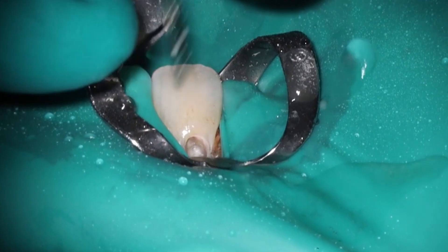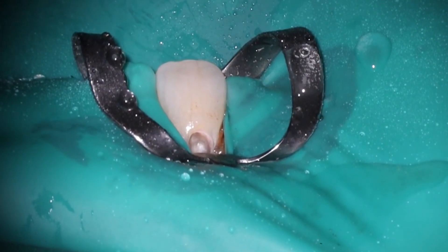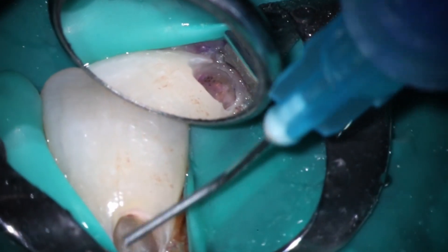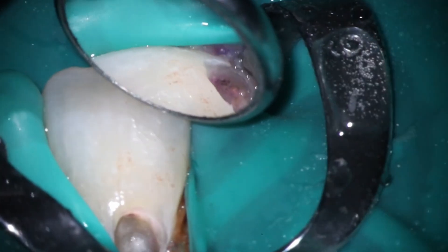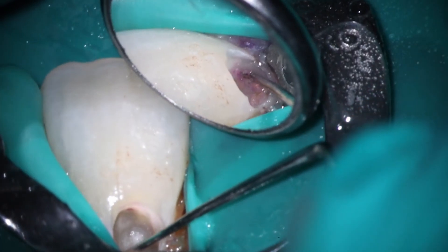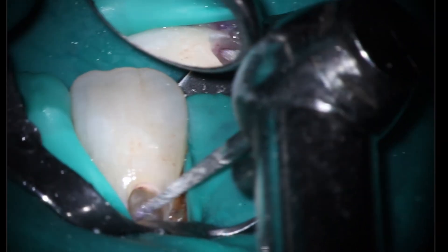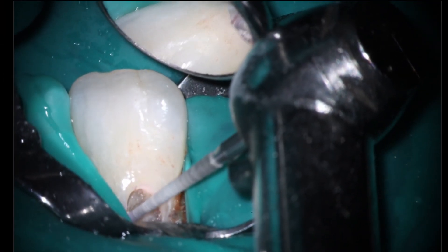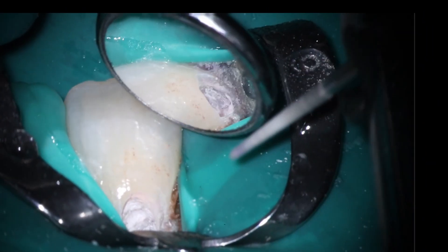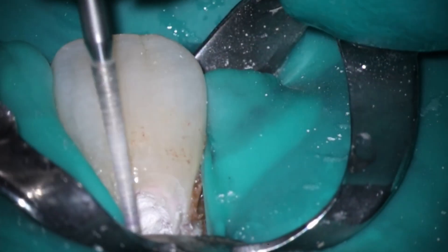Right now the rubber dam is actually on tooth structure. When I've done these in the past, the resorption has been so deep it's actually gone straight to that area where the bone meets the tooth and you actually have to put it on there. You can see right in that spot there's still a little bit of resorption, so I'm going to go back in and remove that. Just want to get out as much as possible using that endo explorer — you can see the stick right there and that is exactly where it is. Going with the long skinny diamond to gently buzz that area out. Getting that spot there. Sorry for the stabilization artifacts — I had to go at some pretty extreme angles because, as you can see, this is not a normal endo access.